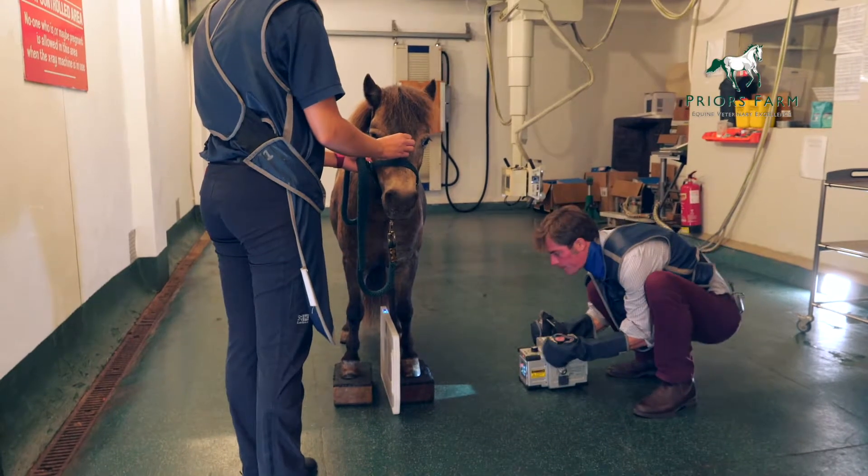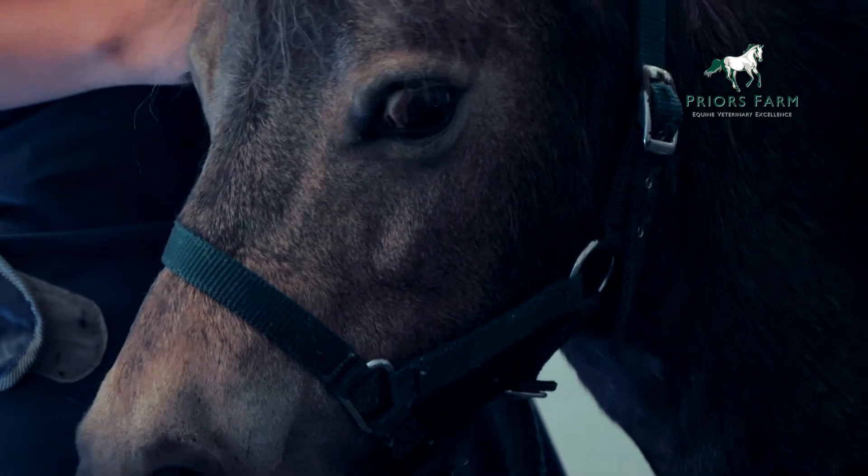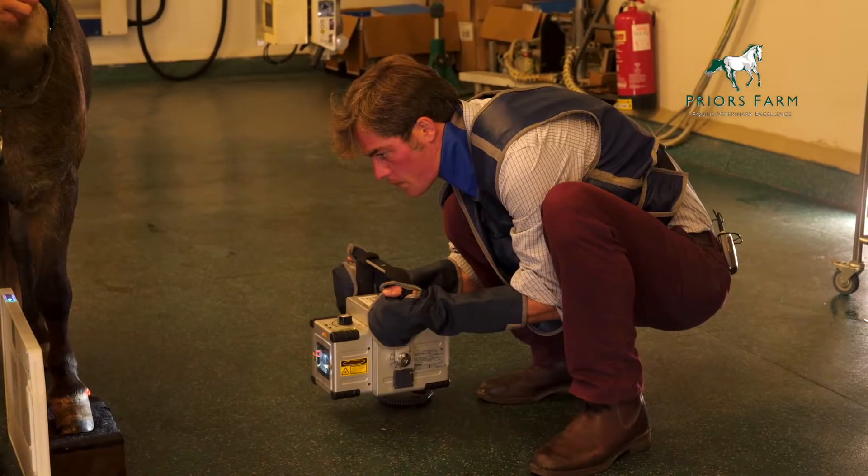To take a radiograph, the horse should be as still as possible. Therefore, we use a small amount of sedation to make sure that the horse stands still. Once the horse is in position, we are very careful to make sure that we are only using a small area of radiation, so we collimate.